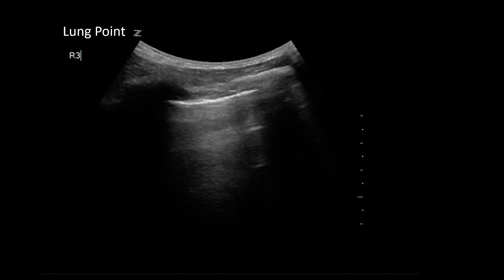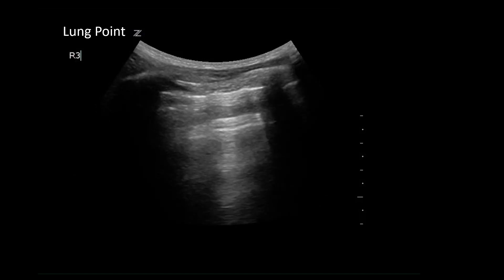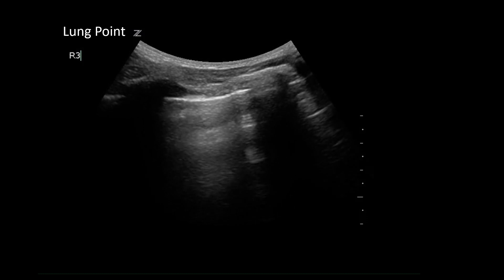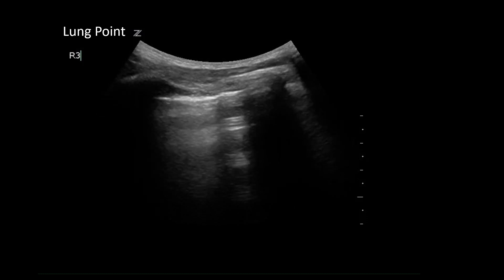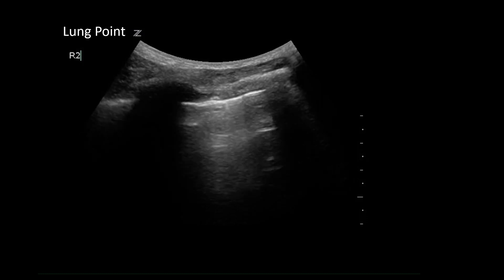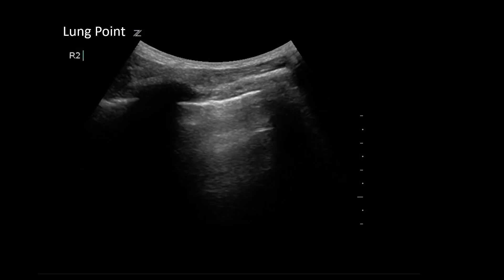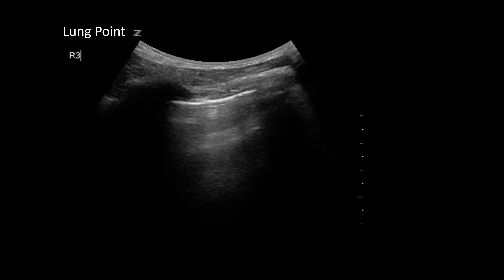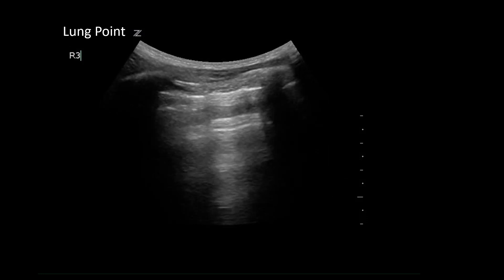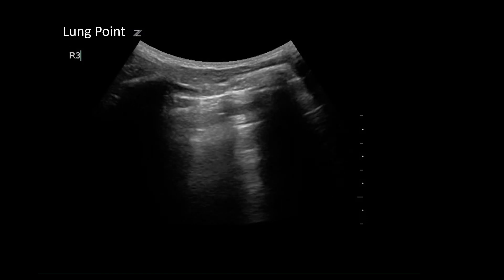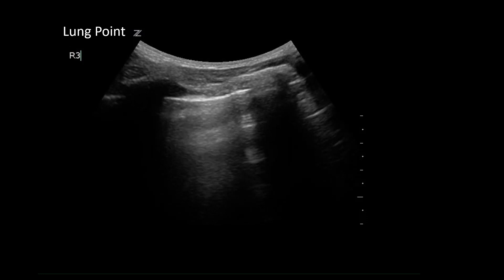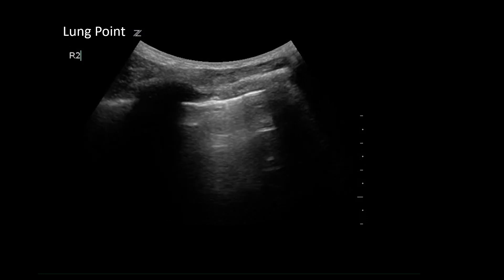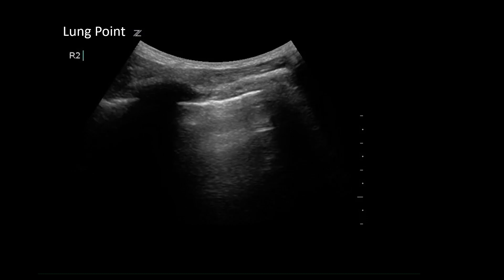A more specific sign for pneumothorax is a lung point, which can be seen here. You can see an area of normal lung sliding on the left of the screen and then the area of no lung sliding on the right. Anytime you detect no sliding, you should slide down the chest with your ultrasound probe to find the lung point.